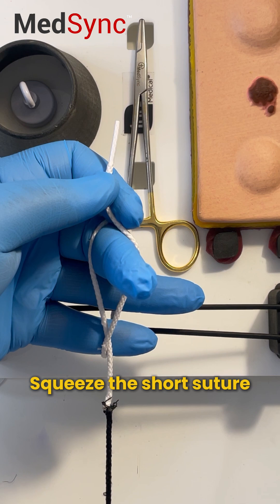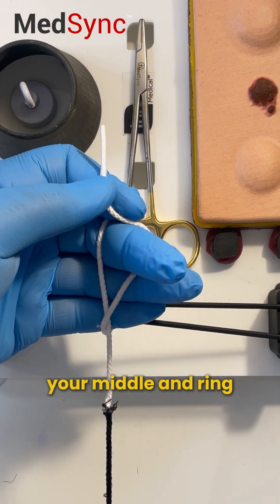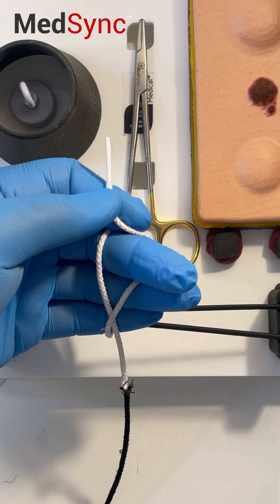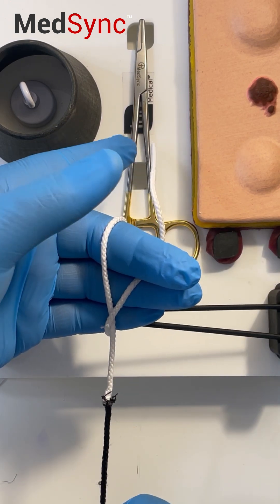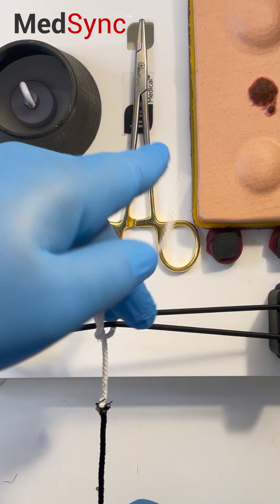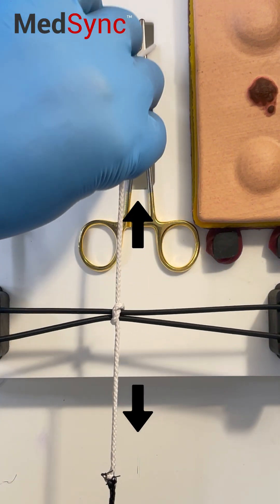Squeeze the short suture between your middle and ring. You now let go between your thumb and index and pull the short suture between the loop.